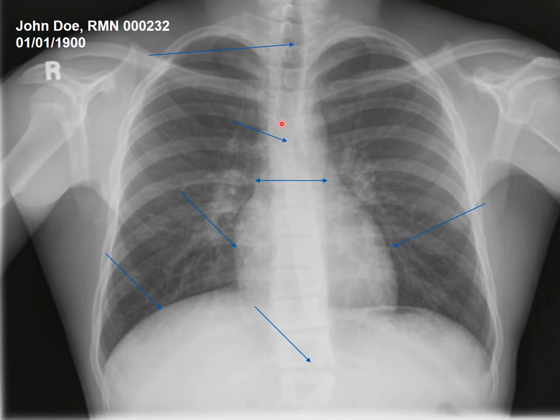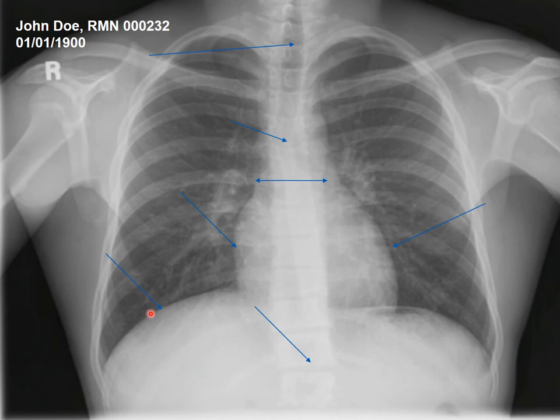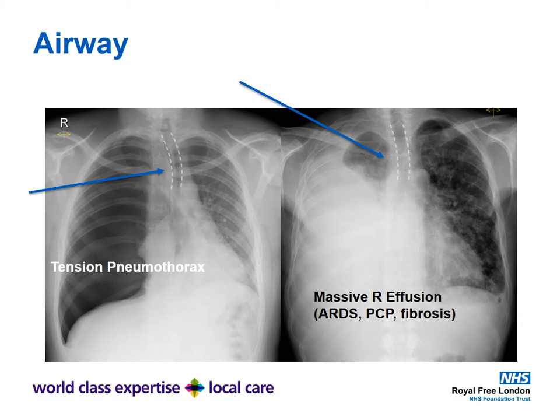Looking at the anatomy: at the top you have the trachea; here is the carina where the bronchus splits into the left and right main bronchus; here you have the mediastinum, the right heart border, the diaphragm, and the thoracic to lumbar vertebrae.